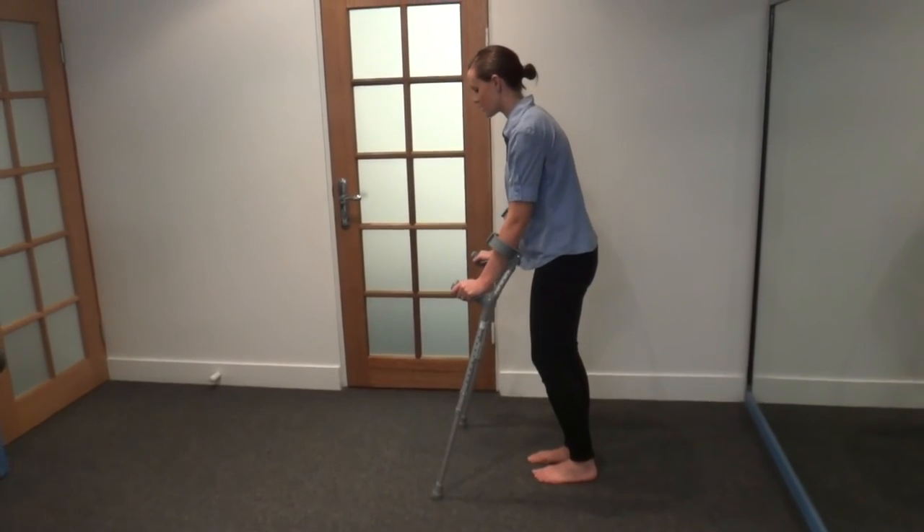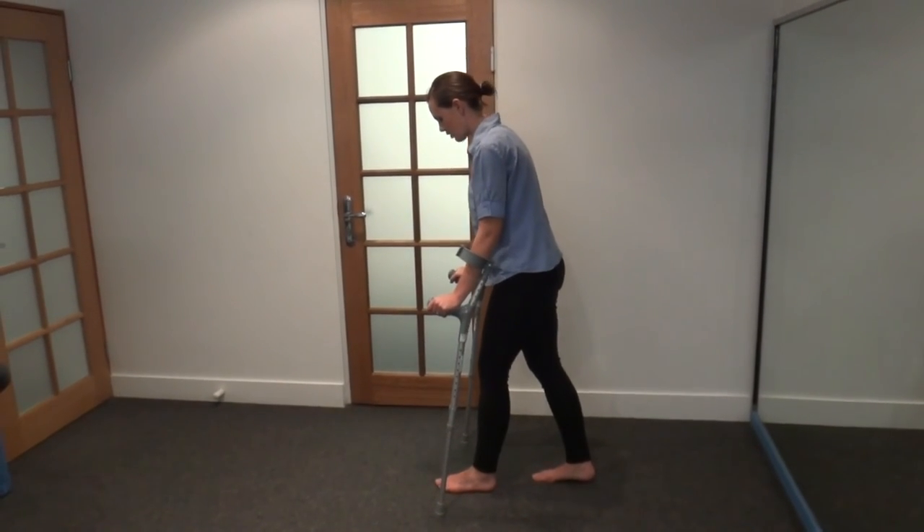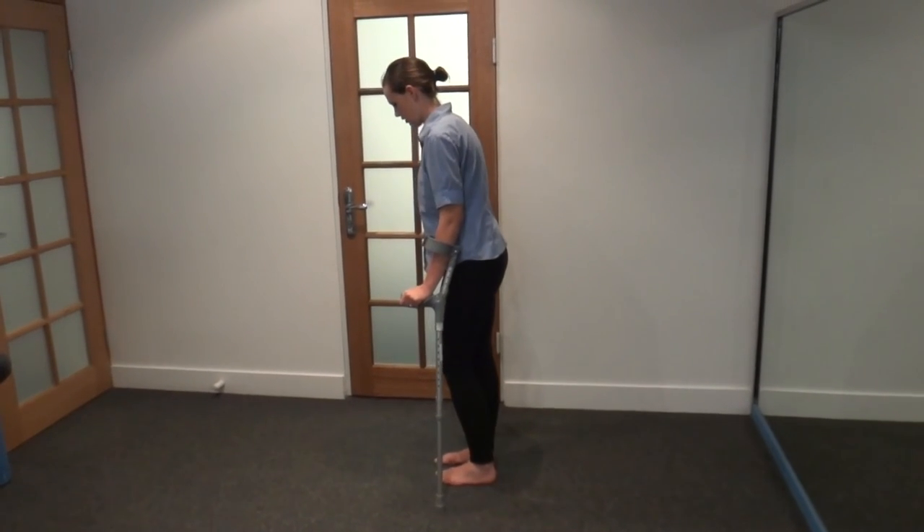Placing your crutches forward, wider than the body, stepping your touch weight bearing foot in line with the crutch, and then weight down through your hands and stepping to the line of the crutch.